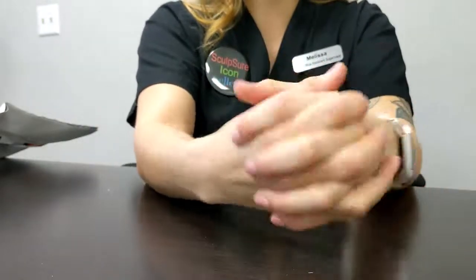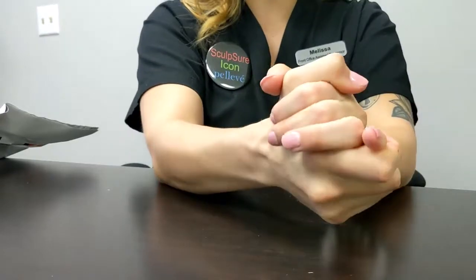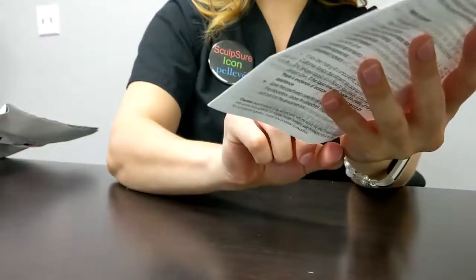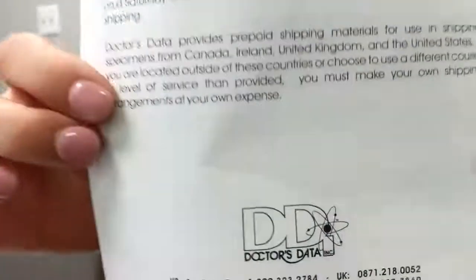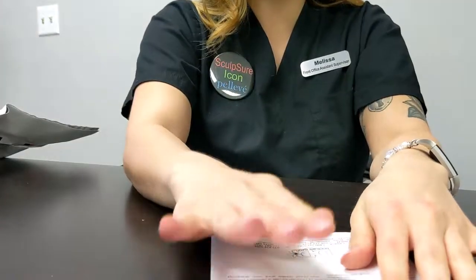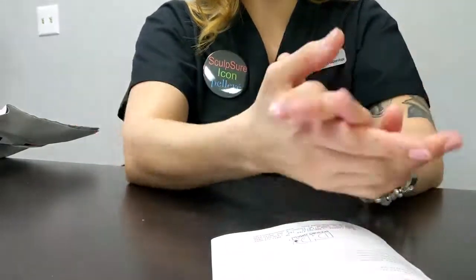Doctor's Data will process this information and send our ordering provider the results so they can interpret them at your next appointment. If you have any questions regarding the collection of this test, please call Doctor's Data at 1-800-323-2784. They have amazing people there that will answer any questions that you have. If they can't answer your question and you're unsure, you could definitely give Optimal Health Spectrums a call.